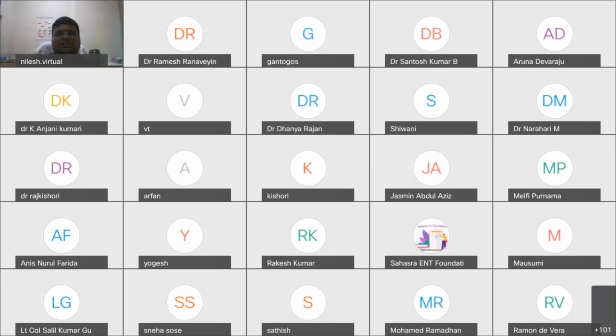To learn the HRCT temporal bone, today itself you download some software, either DICOM or Horos, bring some CD and just try to open it. Once you try to see on your own, you'll feel happy seeing the CT scan. Even when I was not well versed with HRCT temporal bone, I was so scared of it. I used to run away whenever it came to HRCT temporal bone in my PG days. Now that I am seeing more and more scans, I am becoming confident.